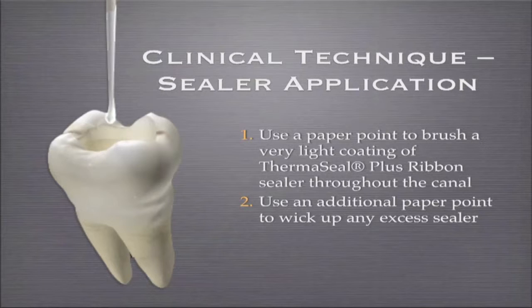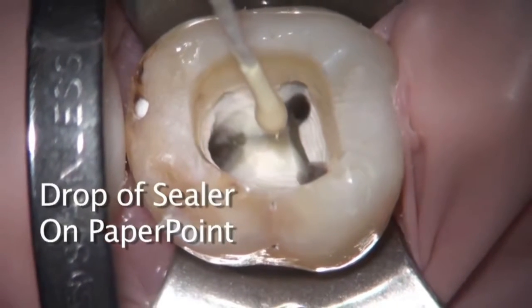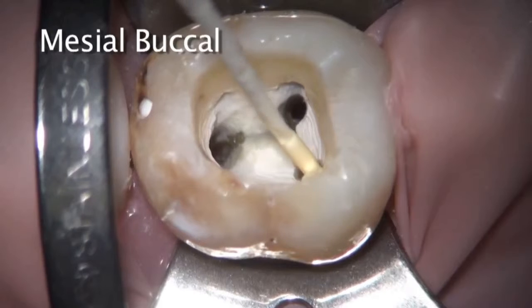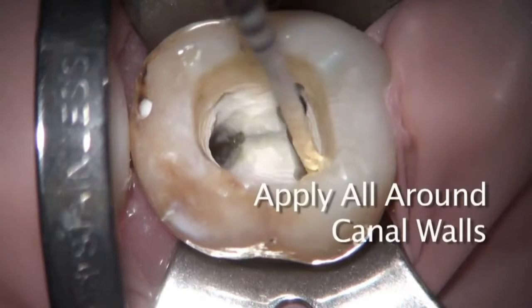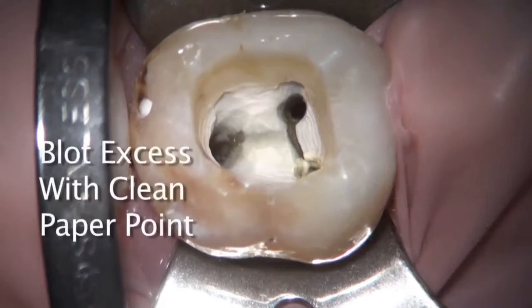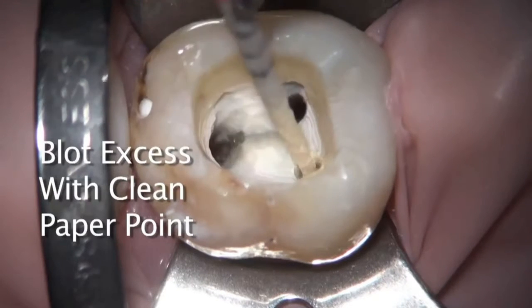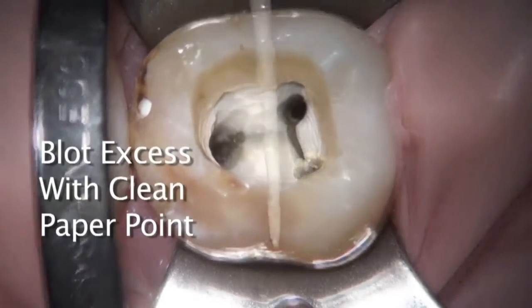You want to pull out any excess. Placing sealer in with a paper point into the mesial buccal canal — just a little bit of pumping action. We do want to move it around and coat the entire canal surface if possible. Then with a series of paper points, bring that back out, and it should look pretty clean.